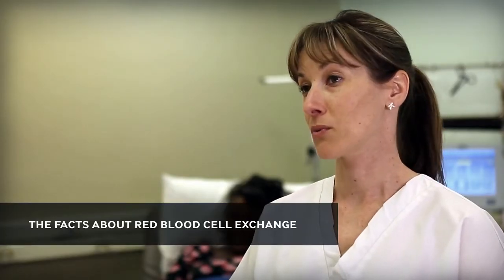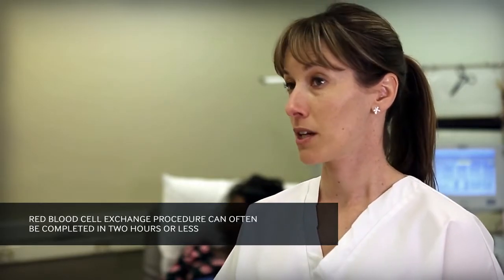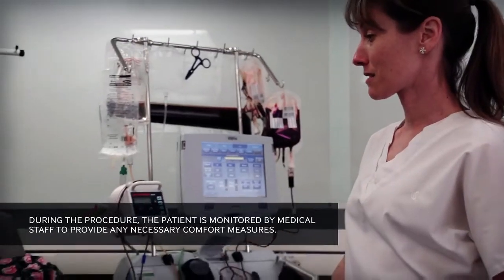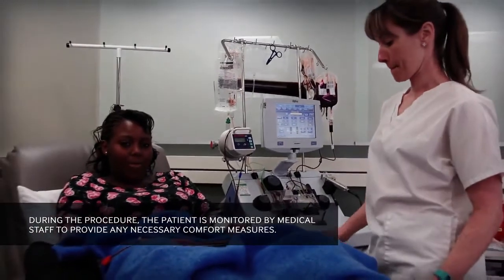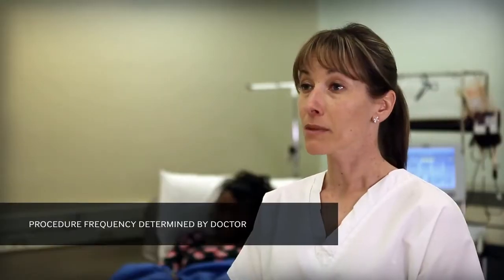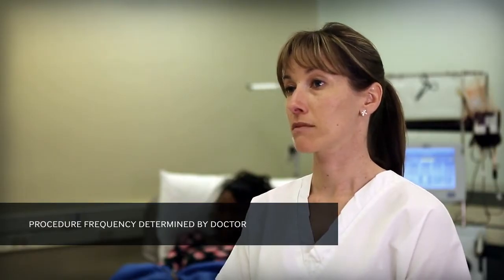Here's what you should know about the red blood cell exchange procedure. The length of the procedure varies from patient to patient, but can often be completed in 2 hours or less. The procedure generally takes less time than a transfusion, where blood is given to the patient and not removed. During the procedure, the patient is monitored by medical staff to provide any necessary comfort measures. The recommended frequency of a red blood cell exchange procedure is determined by a doctor.